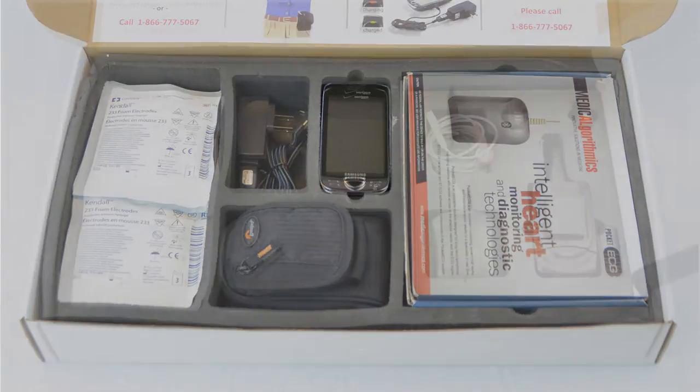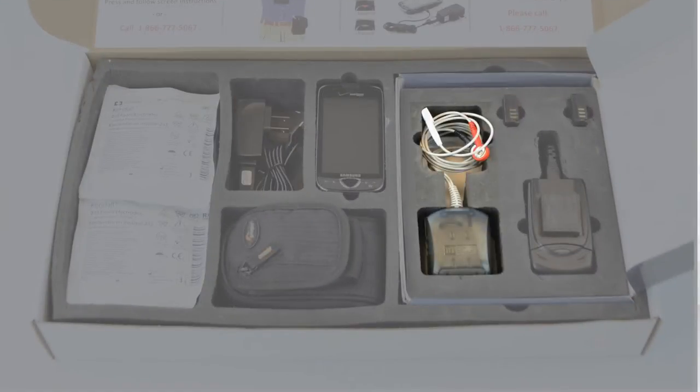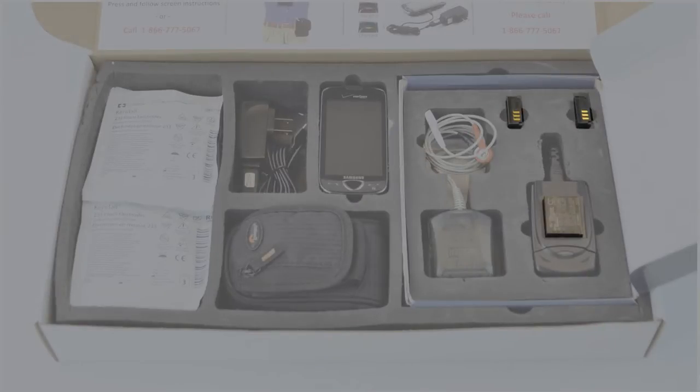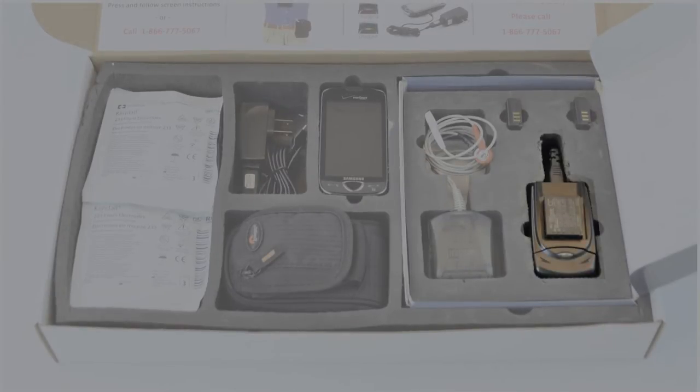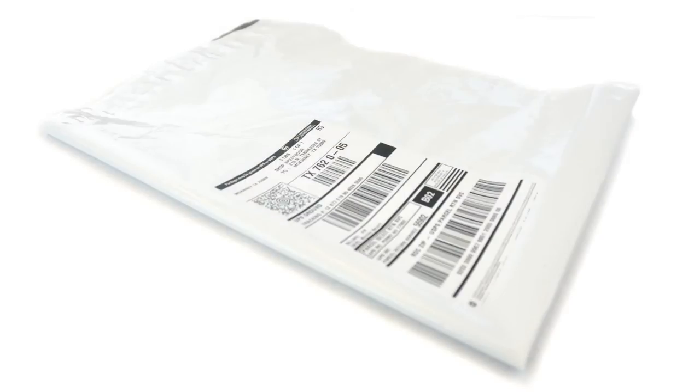The heart monitor box contains the PDA, PDA charger, heart monitor, three heart monitor batteries, heart monitor battery charger, electrode patches, carrying case, and a shipping bag.